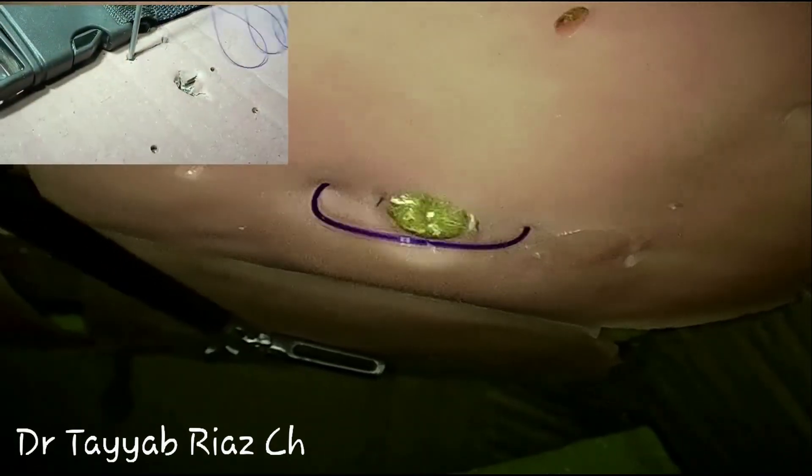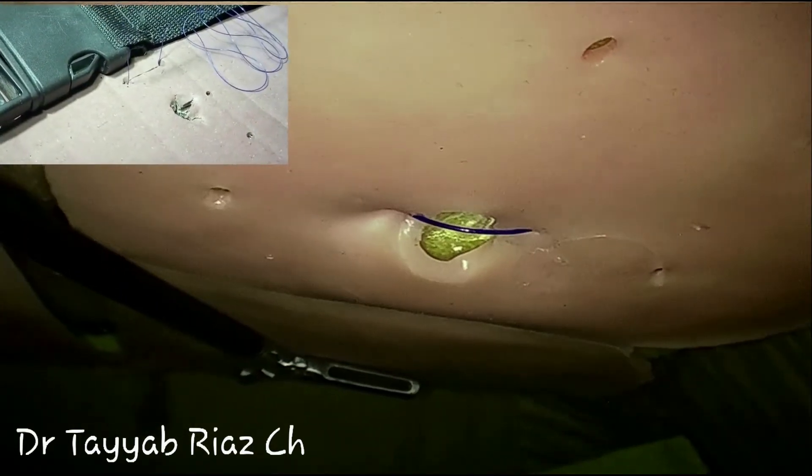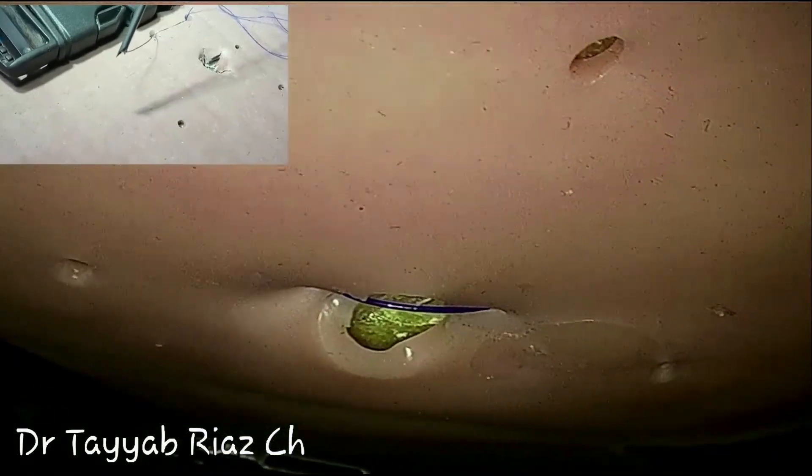Make the extracorporeal knot, and this knot will be buried in that 10 millimeter incision and that will be closed afterwards.